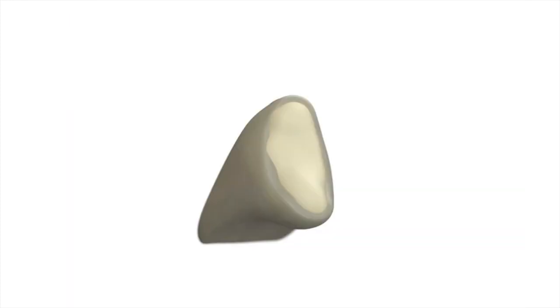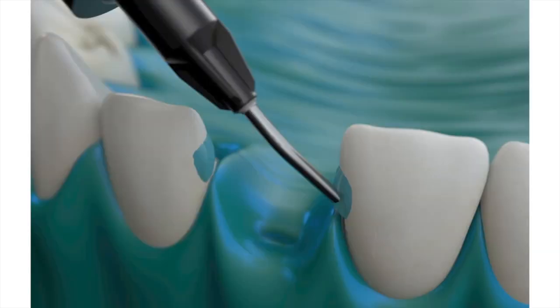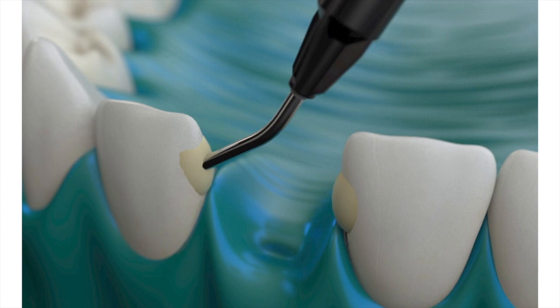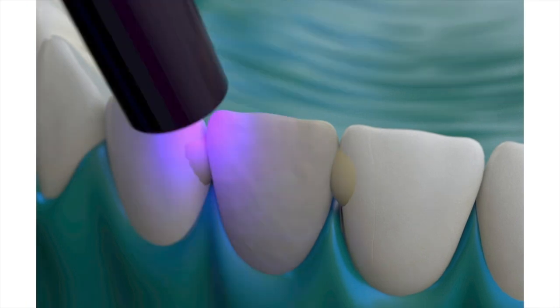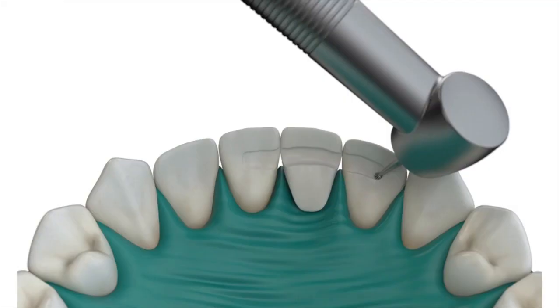When working with a fresh extraction site, create a bullet and place that back into the mouth so it goes about three millimeters into the fresh extraction site. The enamel surface on the adjacent teeth is now prepared with phosphoric acid to allow the bonding material to adhere to the natural enamel. Light cure your unfilled resin as per the manufacturer's instructions. Place a little bit of composite into the contact area — this will allow the denture tooth to stay in place. Once the denture tooth is inserted, use a plastic or gold instrument to sculpt the contact areas prior to curing.